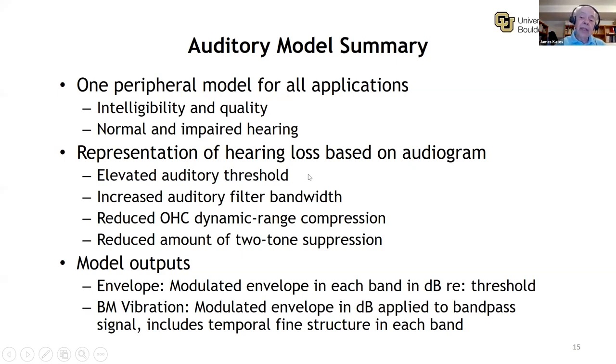And this is tied into, I think, some of the tip to tail differences in the impaired filters where the low frequency gain is much, much higher than the low frequency gain in auditory filters in a healthy cochlea.